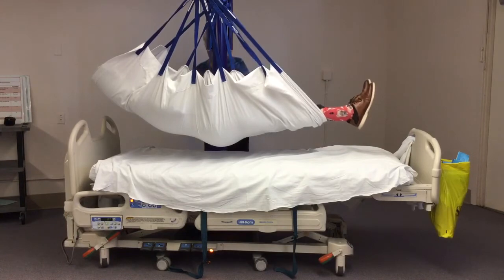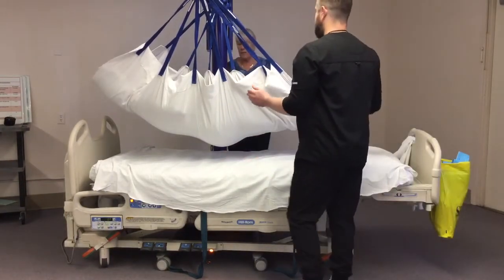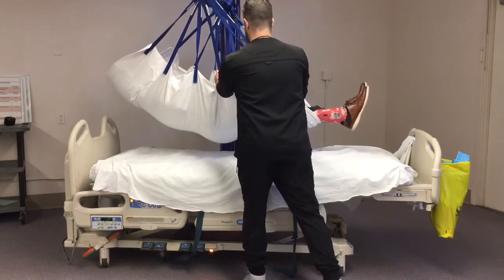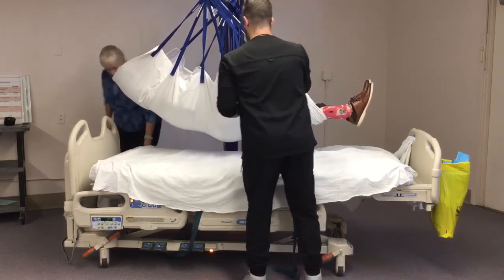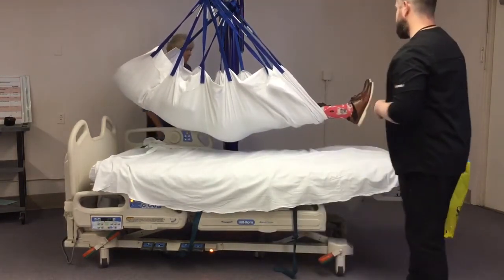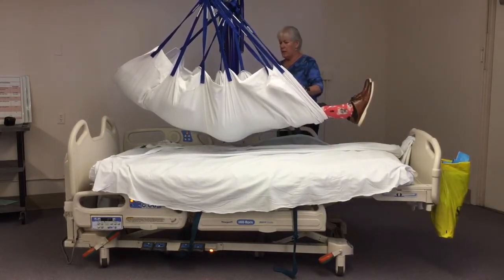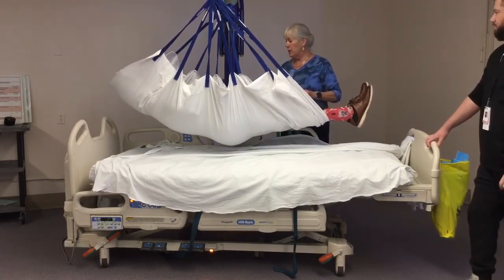Now if I want to move my patient side to side in bed, let's say I'm going to roll him. So now I'm going to use my feet, I'm going to pull the patient towards me, and I'm going to pull him right over to the edge. I'm going to put that rail up for safety. Then, right next to the edge of the bed, I'm going to lower my patient back down again.